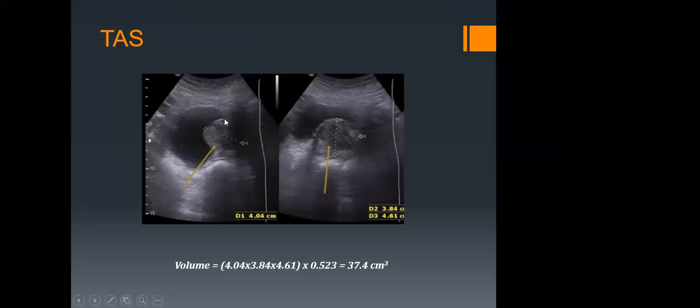But we can't define this anterior capsule. Please don't attempt to extrapolate to what you cannot see. We can't see the capsule here. So this is the preferred method of doing it. At least here we're able to see the capsule, part of it. So take this one parameter, which is the longitudinal, and then do the other parameters from the actual image.